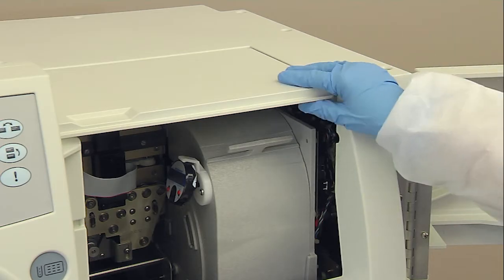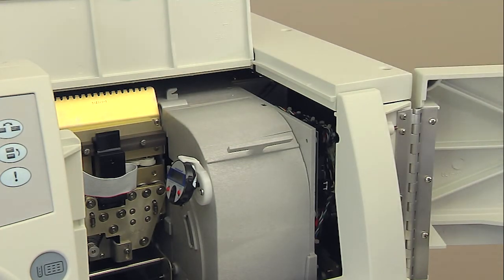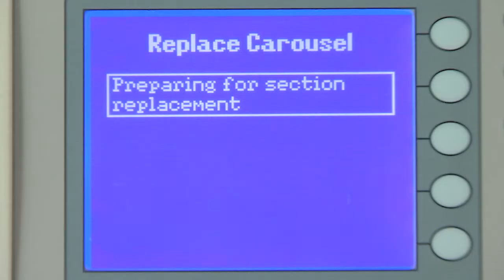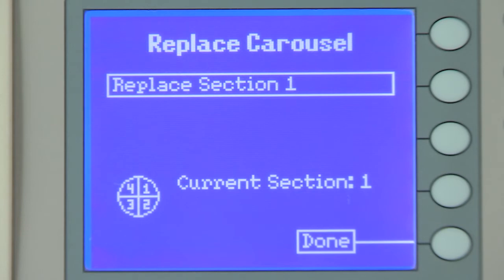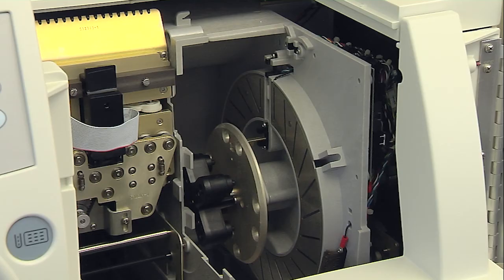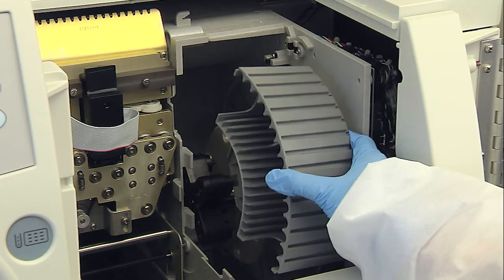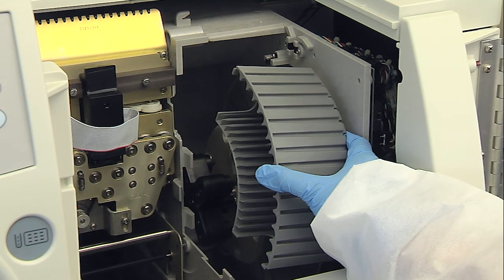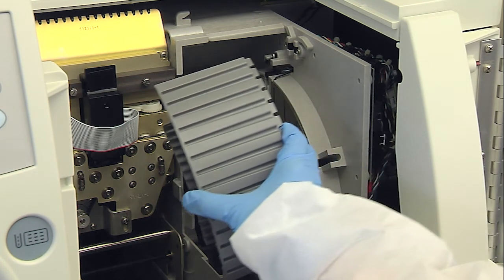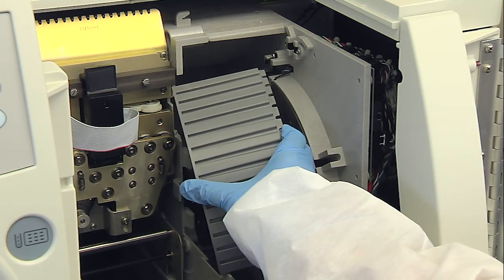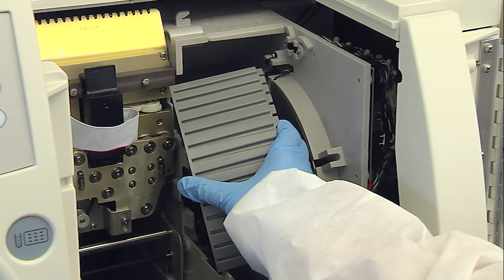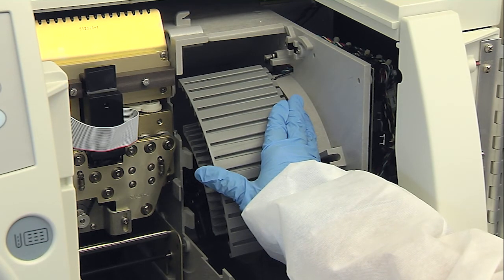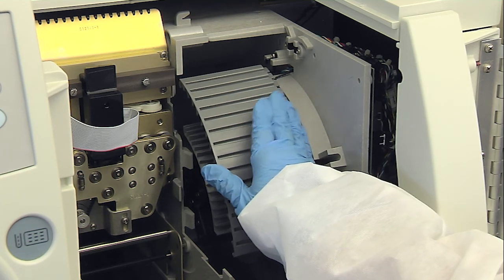To gain access to the carousel, open the front and top user access doors. Remove the carousel cover by grasping the handle and lifting the cover straight up from the instrument. When the user interface displays the message Replace Section 1, take one of the four clean, dry carousel sections and orient it so the bottom narrow end is touching the front of the brass disc located in the center of the carousel. Tilt the top of the carousel section towards the left, then push the carousel section down towards the center of the brass disc. Once the section has been pushed into place, allow it to spring into its natural position.